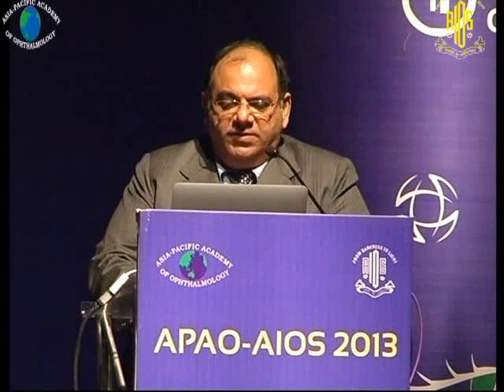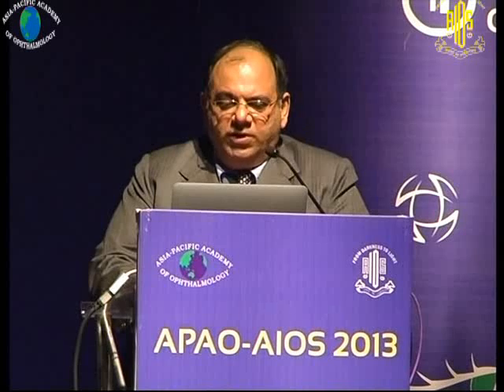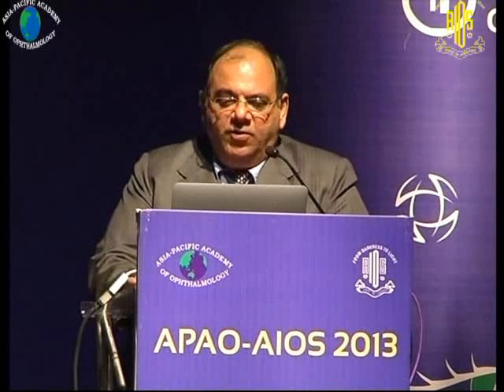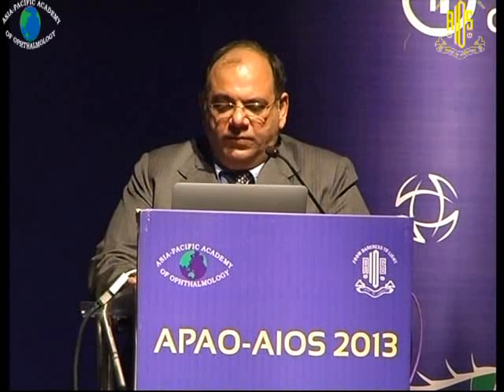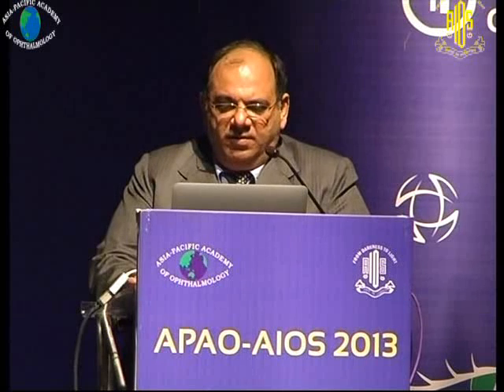It required the simple approach of just dilating the pupil mechanically under sodium hyaluronate, which suffices quite well and gives fairly good results, and is quite an easy procedure, while with iris hooks and all, the whole procedure is quite traumatic.